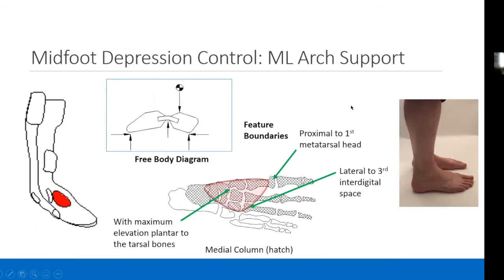The medial longitudinal arch support: Kogler actually had a beautiful paper where he and his team measured the plantar fascia strain as a function of medial longitudinal arch support. They got cadaver limbs and they instrumented the plantar fascia with strain gauges and measured the effect of wedges as well as arch support on plantar fascia strain, and saw a definite link between the two.